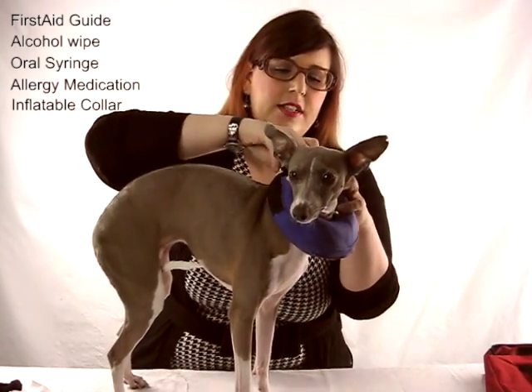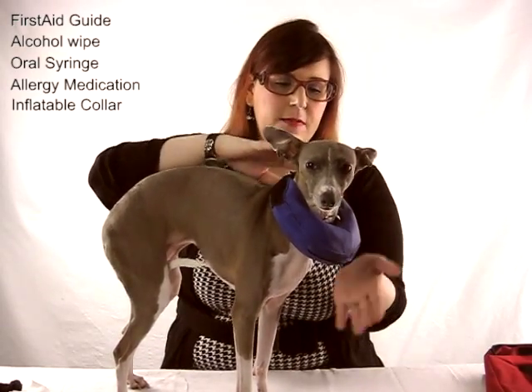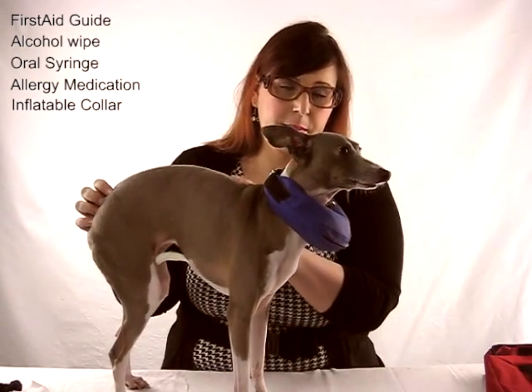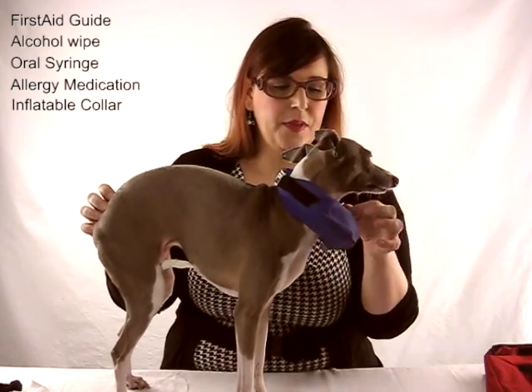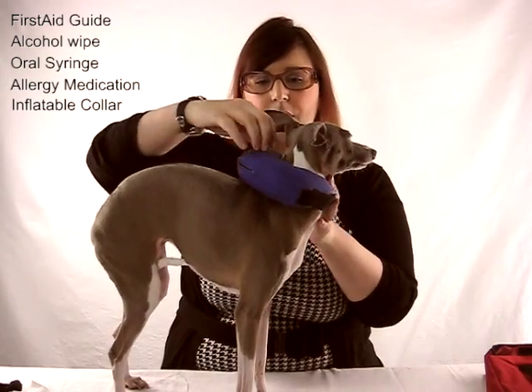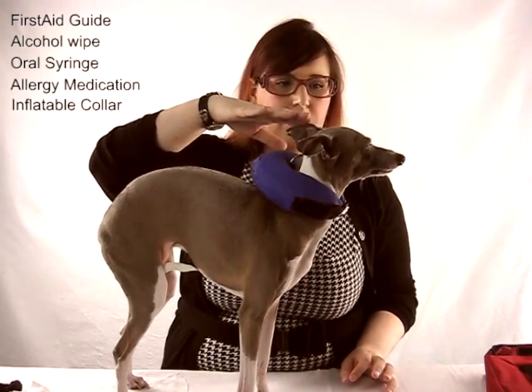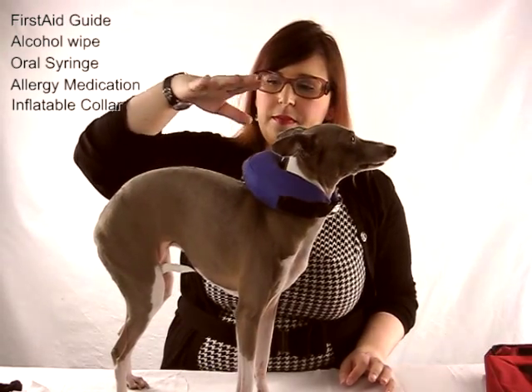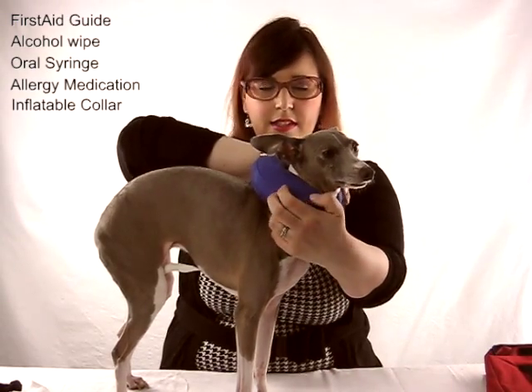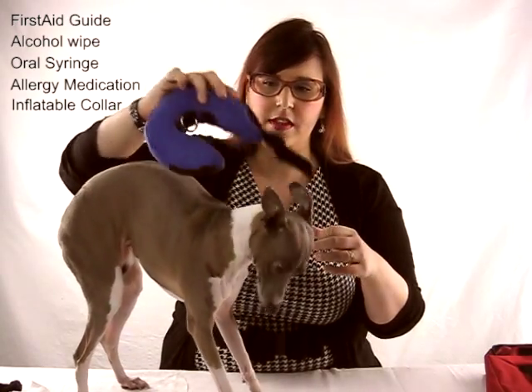You tie it and tie your collar as well. This is made by Kong surprisingly enough, and essentially it is an inflatable cone of shame — or in this case, a doughnut of shame. It also has a hook so you can walk your dog with the doughnut on them. It helps keep them from licking any areas they shouldn't be going at, and it's less annoying than a regular cone of shame.